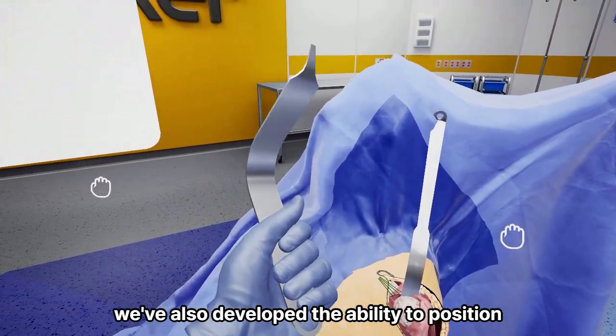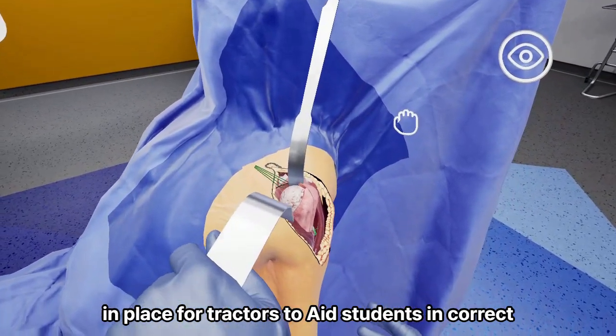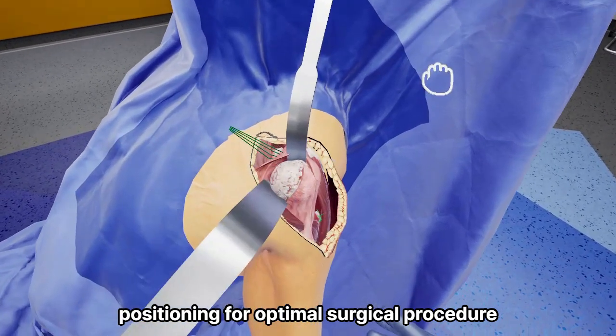We've also developed the ability to position and place retractors to aid students in correct positioning for optimal surgical procedure.